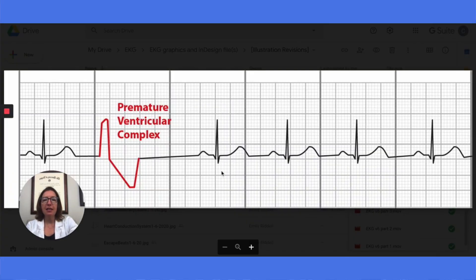When we look at this strip, we can see that the right-hand side looks really normal. We've got nice little P waves followed by a nice narrow QRS complex. Our rhythm looks regular and our rate looks about right. But what went down over here? Well, what went down is a premature ventricular complex or PVC.